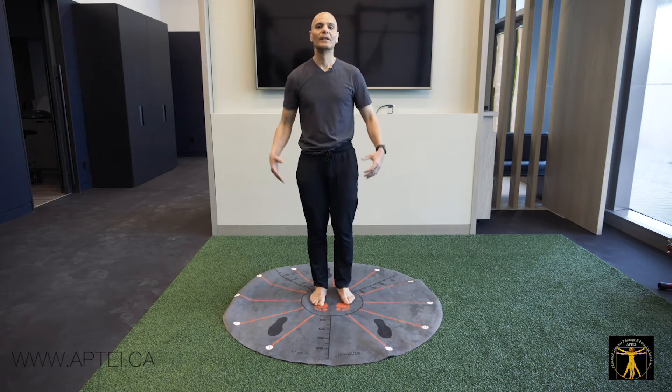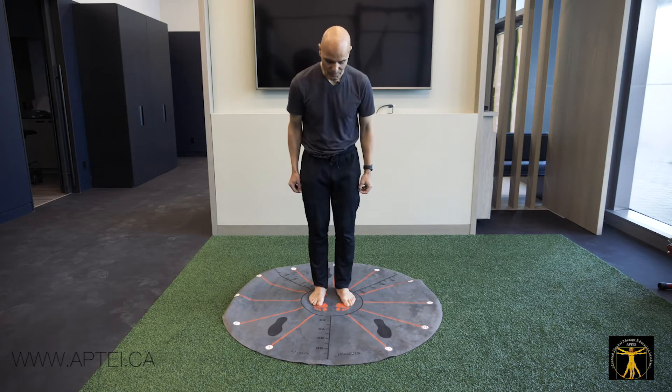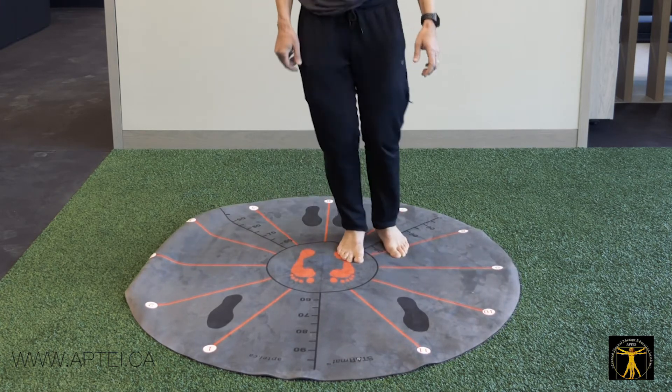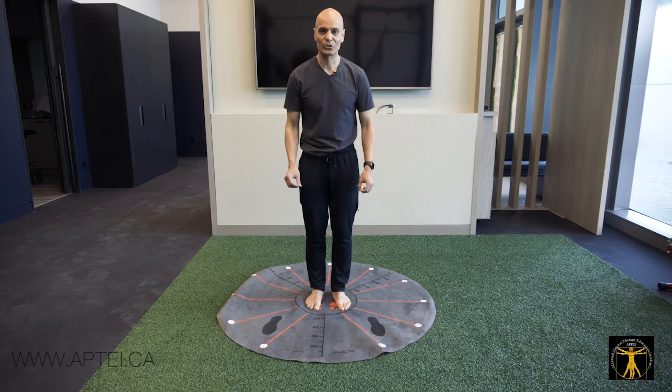When you want to train more functional or cardiovascular work, I do small jumps. You jump to 1 o'clock, 2, 3, 4, 5, 6, 7, 8, 9, 10, 11, 12 o'clock. That's called quick short jumps.